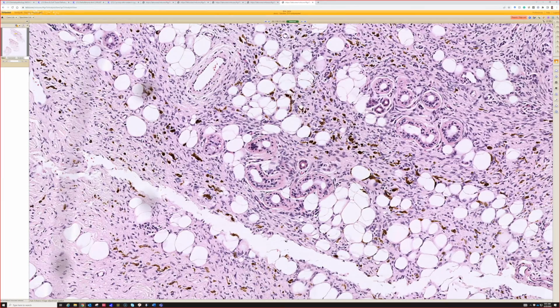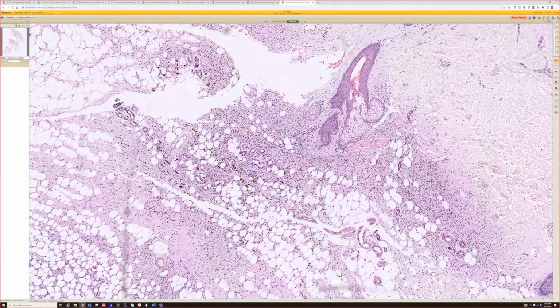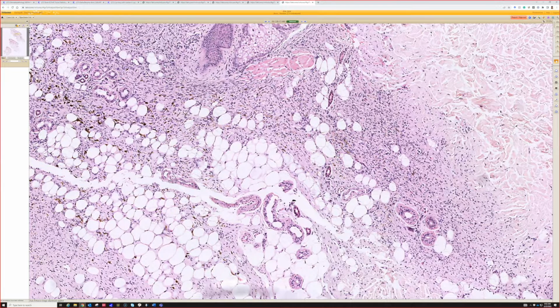So what's the eponym that we apply to this tumor? Bednar. Yeah, this is a Bednar tumor. So when I see this, I just say DFSP with focal melanin pigment, open parentheses, Bednar tumor. So basically, I will still use that term because people recognize it, but I always still top line it as dermatofibrosarcoma protuberans because that's all it is.